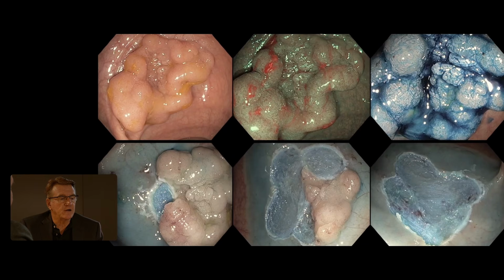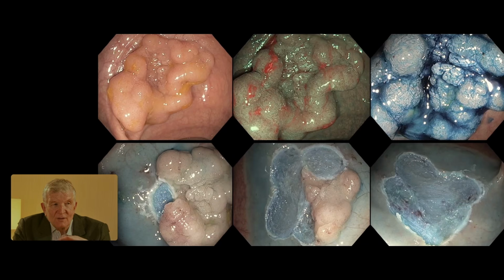We'd just call it 2A, because when you add the C, it means there should be a high risk of cancer, which I don't think applies in this case. So it's always measured according to the plane of the surrounding mucosa. Correct. The C should be deeper than the surrounding mucosa. And if the central depression or the central flat area is normal and has a granular pattern?